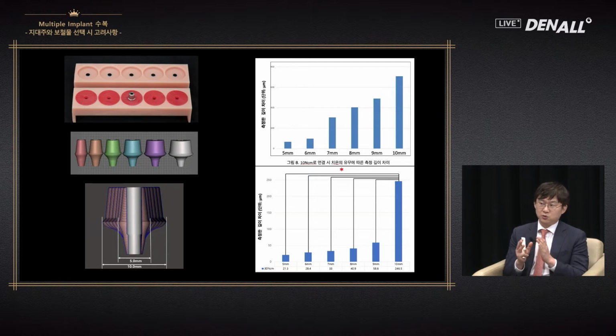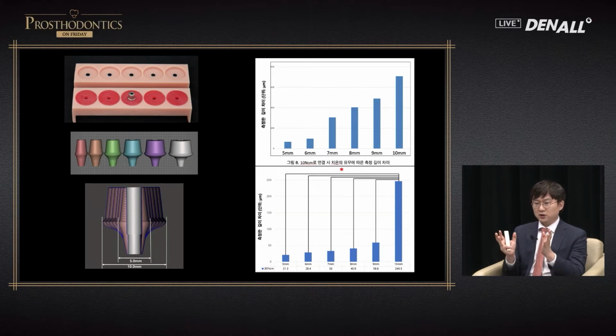If the custom abutment is bigger than the healing abutment, at the beginning it does not sit fully, and over time it goes down. It may look like sinking. So I did an experiment using an artificial gingiva. The thickness of the healing abutment is 4 millimeters in diameter and the gingiva height is 3 millimeters. This can be different from the actual mouth.